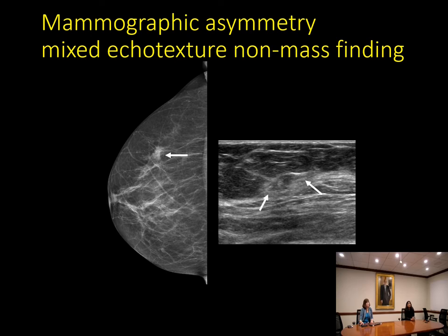This is an example of a mammographic asymmetry — a one-view finding on the lateral side of the right CC view, with a possible suggestion of architectural distortion. On ultrasound, this corresponds to a non-mass finding with mixed echotexture, some hypoechoic and some more hyperechoic areas, oriented parallel to the skin surface and normal breast tissue planes. This finding is quite subtle unless you're looking specifically for it in this location — it would be very hard to pick up on screening breast ultrasound.